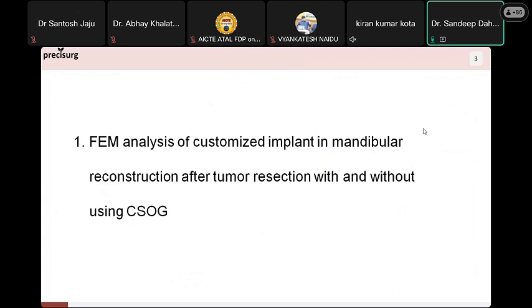We have also performed a finite element analysis in this case. Here we perform linear analysis by using ANSYS 14. With the meshing, we obtain around 3000 nodes and 1500 elements. We imported the data in the IGS format. Also, this implant is uncemented type. Uncemented type means we are not using any cement in the implant.